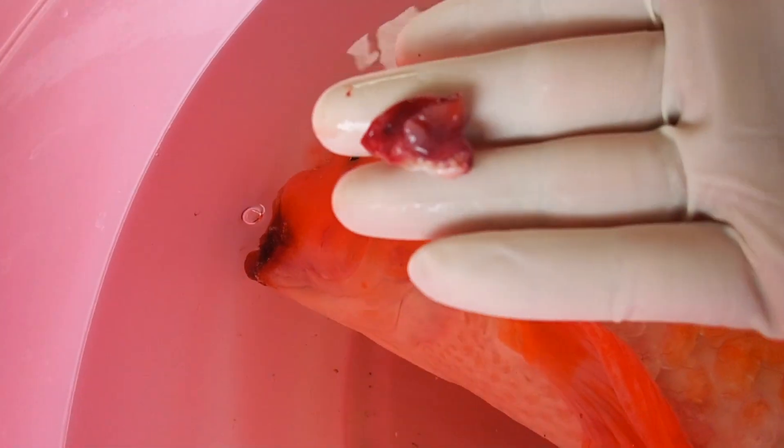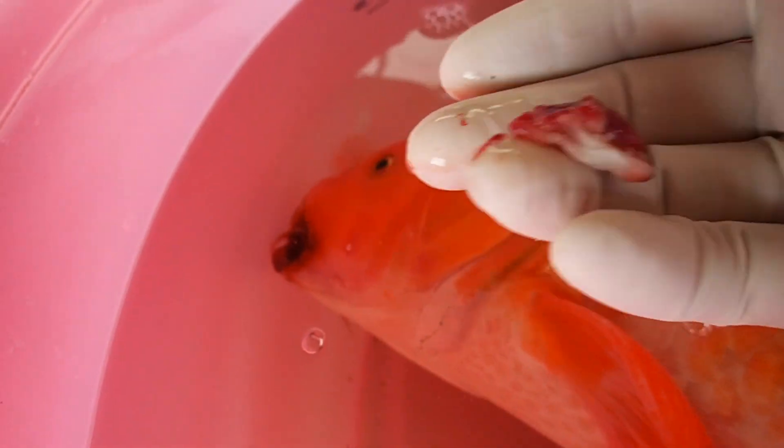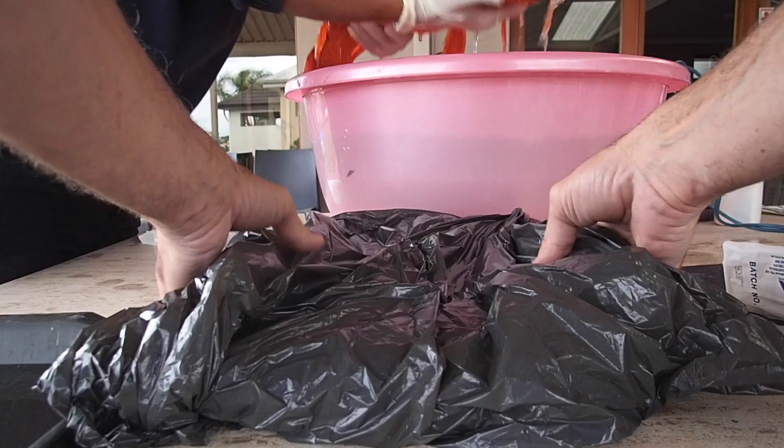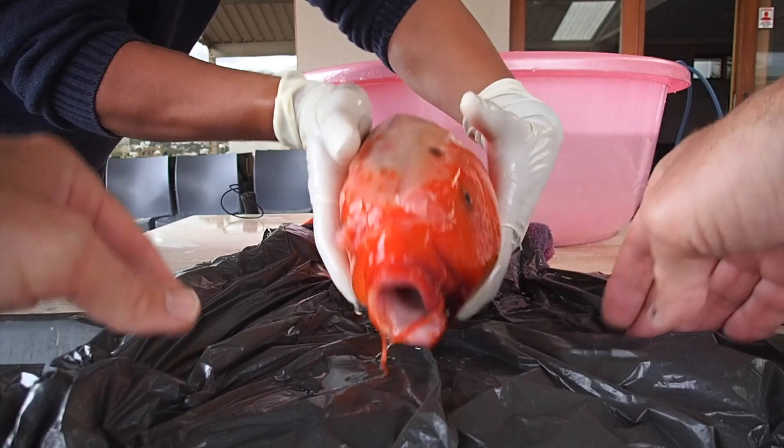We removed this loose flap of skin which was part of his injury because it wouldn't have a good blood supply and so it would become infected. An infection was confirmed when I examined it under histology.